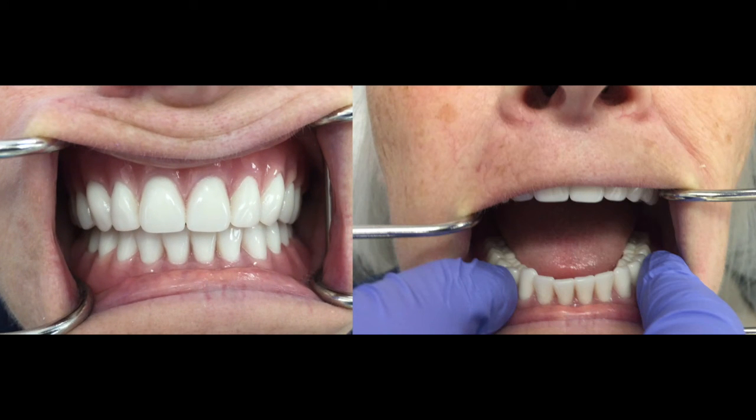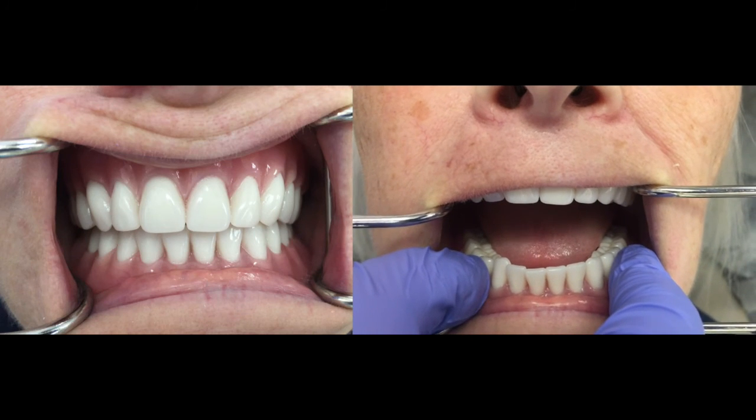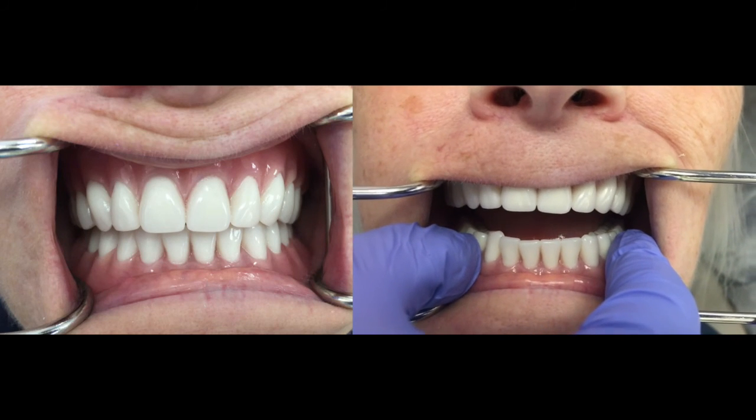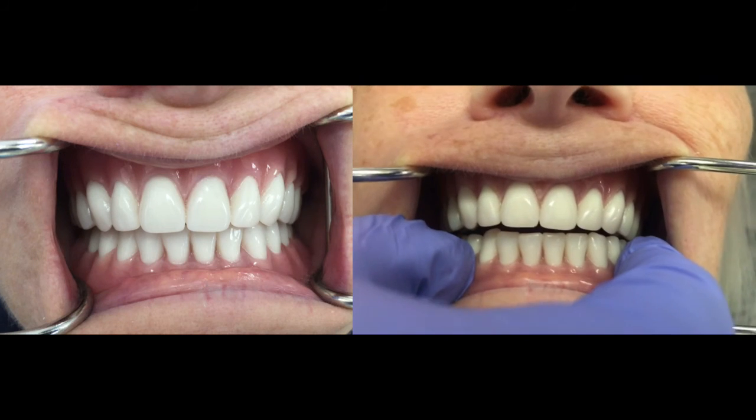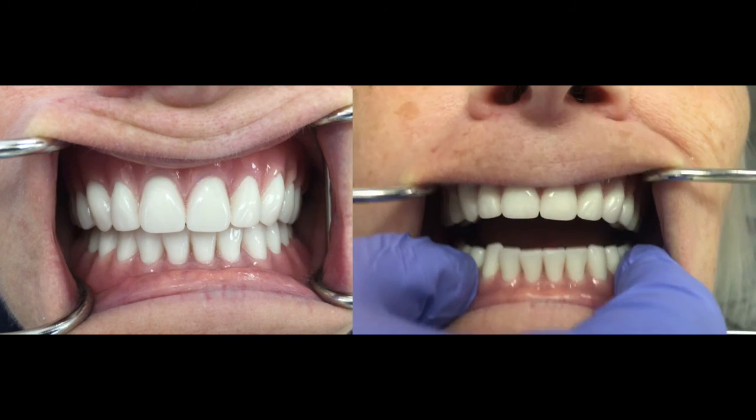So I wonder how many people will notice whether the occlusion is right or has a problem. Let me show you one more video. Close gently, and the same thing. If you feel something touch, stop it. Open. One more time.